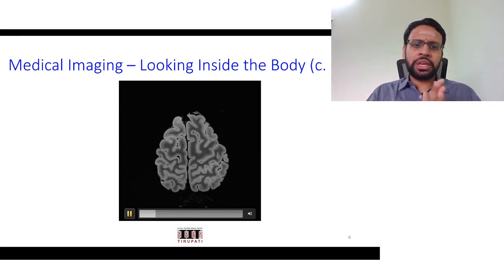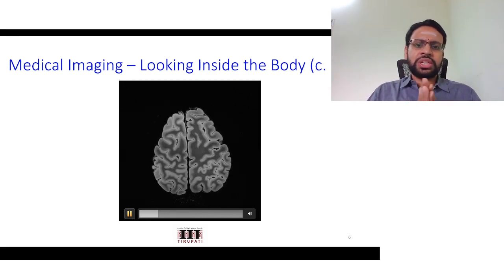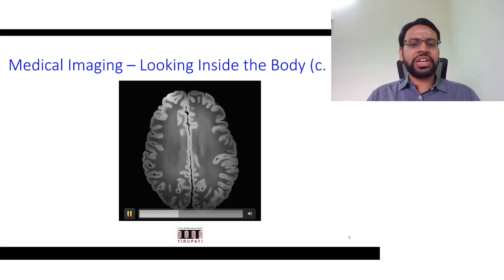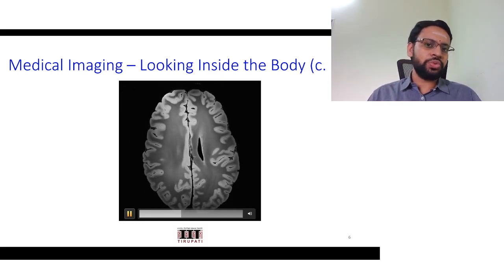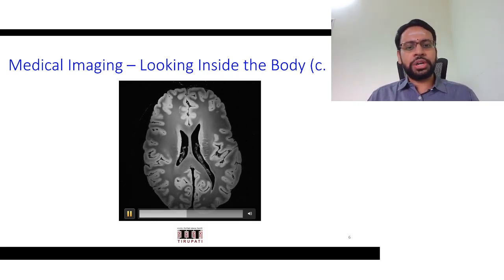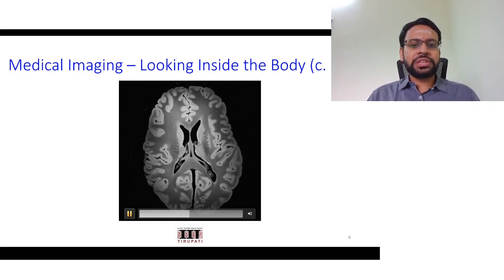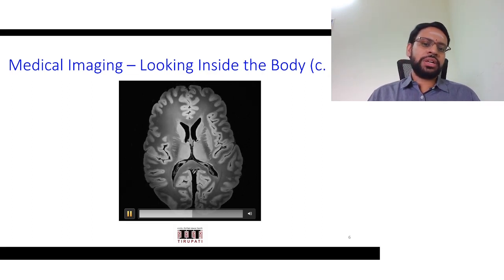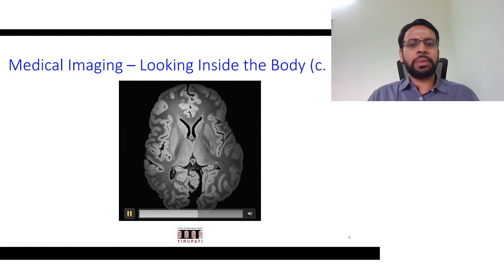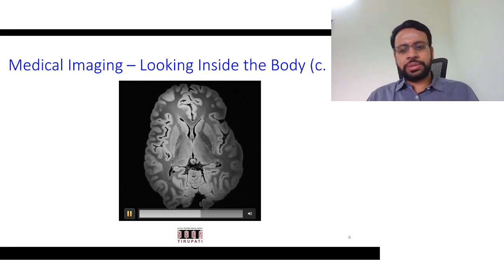This is done by Massachusetts General Hospital, MGH, and even for our routine checkups of MR imaging, you would get resolutions of the order of millimeters very comfortably, 1 mm, 0.5 mm. These are quite common resolutions that you would get with MR imaging. So that's the kind of advancement that has happened over the years.